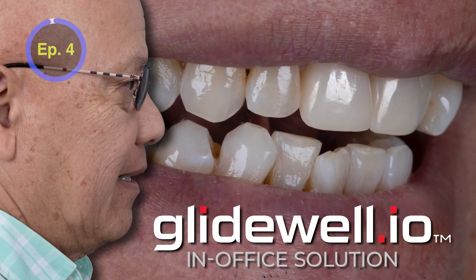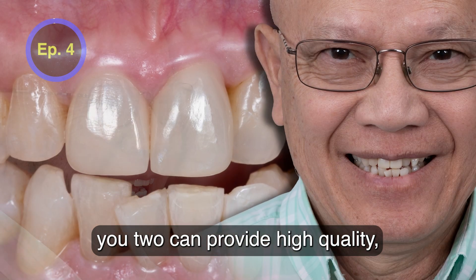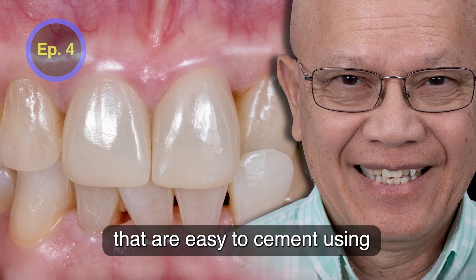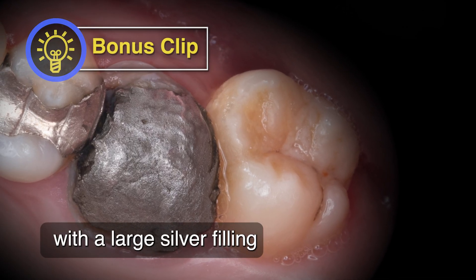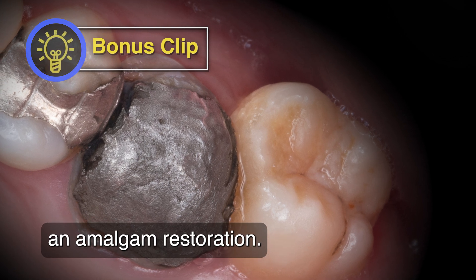Same-day crowns with Glidewell's in-office solution. You, too, can provide high-quality, strong, and beautiful Bruxer Aesthetic Now crowns that are easy to cement using Bruxer Cement. This is tooth number 14 with a large silver filling, or what we call in dentistry an amalgam restoration.